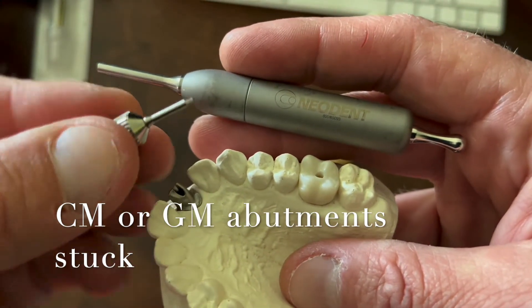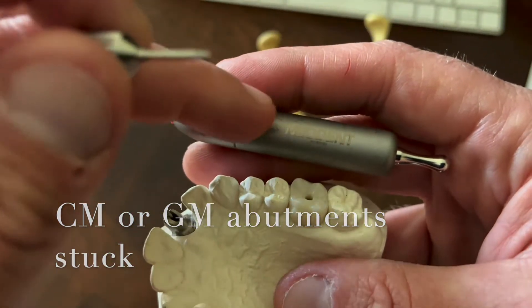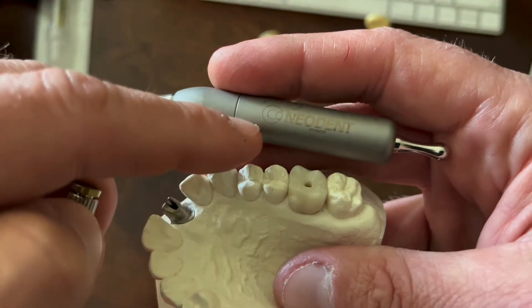Quick video today. I'm going to show you two tools: the screwdriver and the strike hammer from Neodent.